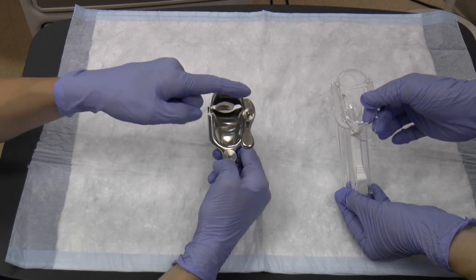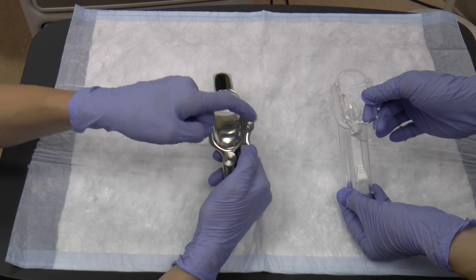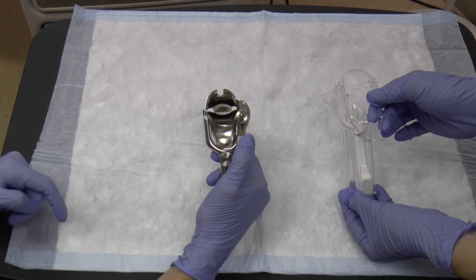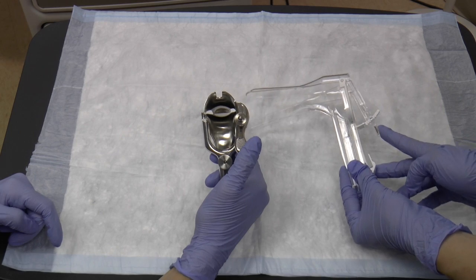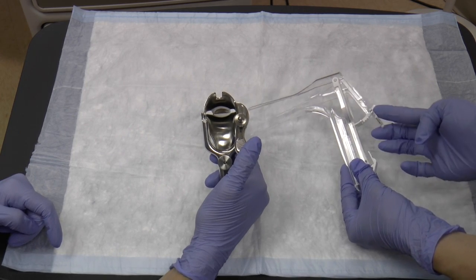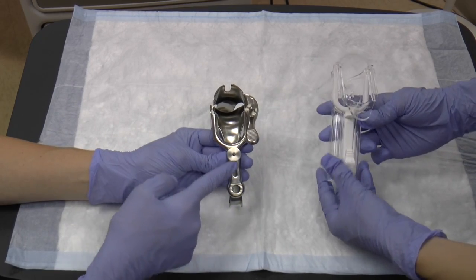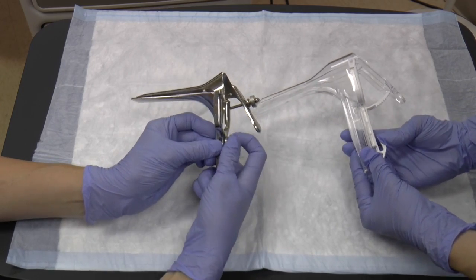There is a locking apparatus on the thumb hinge. The metal speculum has a knob and uses a screw mechanism. The plastic speculum has angled teeth and uses a ratchet mechanism. The speculum handle can be adjusted to move the upper and lower blades farther apart. The handle lock uses the same mechanism as the one on the thumb hinge.